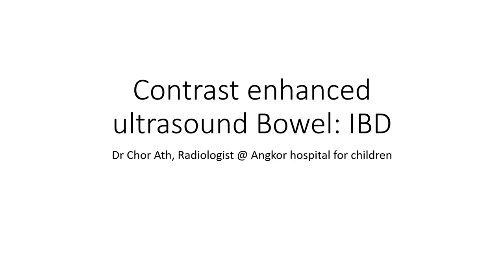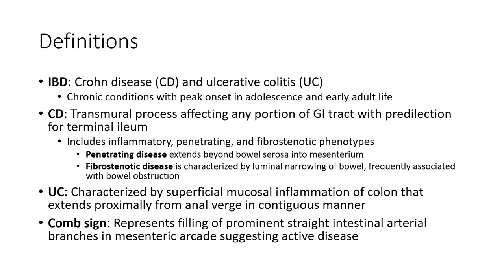Hello everyone, today I'm going to show you about ultrasound in inflammatory bowel disease. Definition: inflammatory bowel disease. Today we will focus on Crohn's disease and ulcerative colitis.